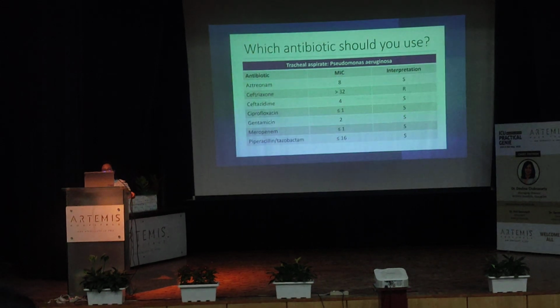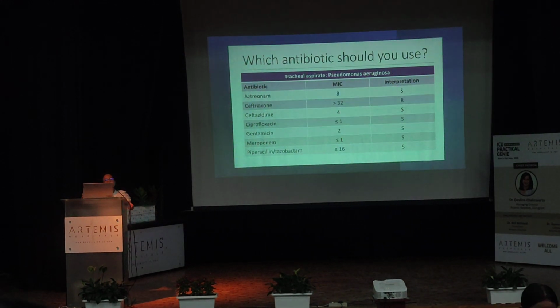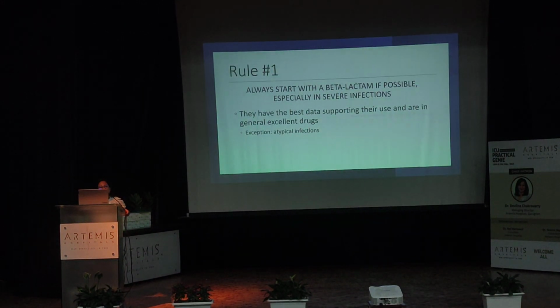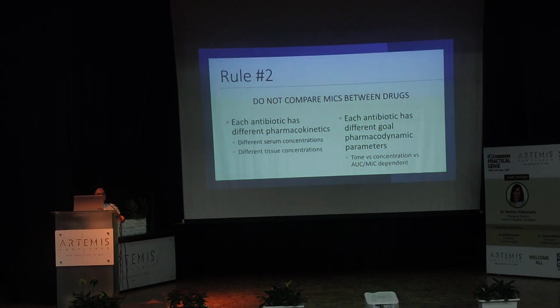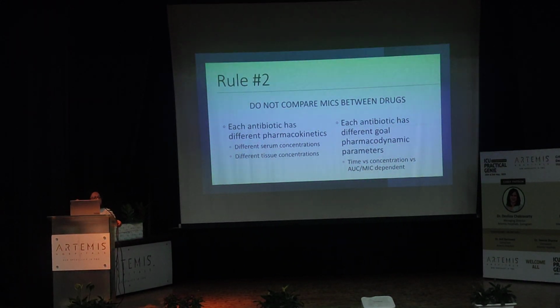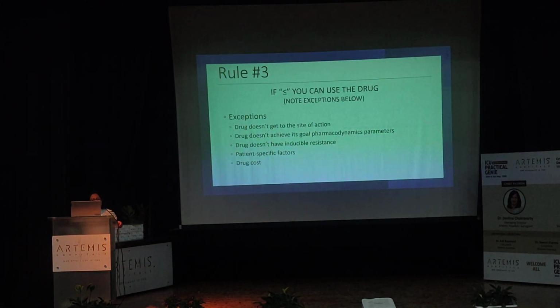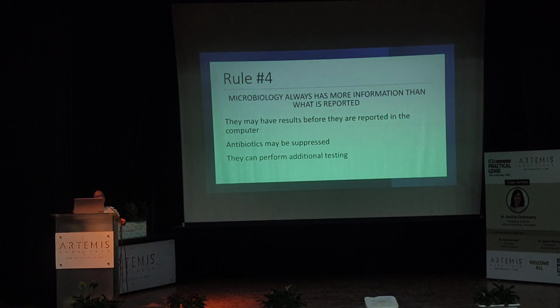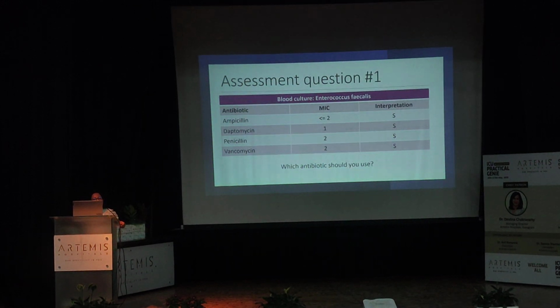We reserve carbapenems or fluoroquinolones for difficult infections because these have a tendency to develop resistance. In difficult to treat Pseudomonas organisms, we will add these. After getting the sensitivity report, and we have seen this is sensitive, this is resistant, then we have to go ahead with pharmacokinetic and pharmacodynamic data and how much is the penetration, which I have already explained. The microbiologist always knows better. If we want to convert to some oral formulation, or get some other sensitivity, we have to ask the microbiologist.